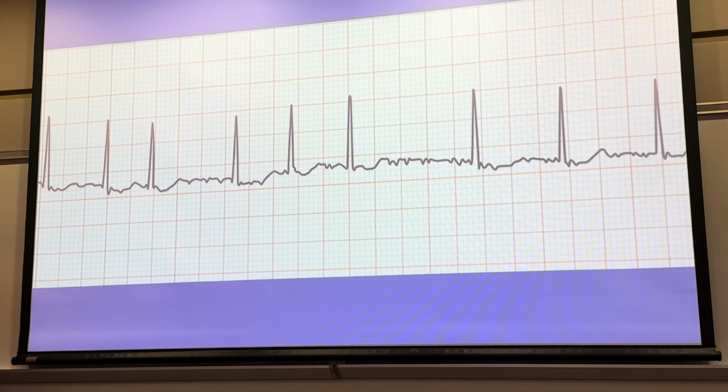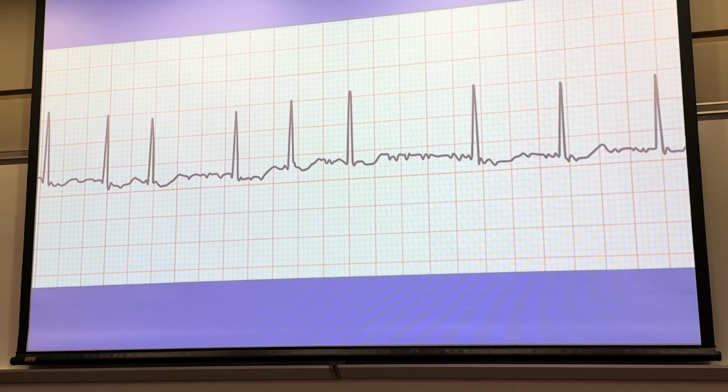All right, Chuck, what do I have? AFib. AFib, you sure? Everybody agree with Chuck? I agree with Chuck. Okay. Anything in particular that I need to worry about with AFib? Clots, okay. Remember, those atriums are quivering, and that blood is not able to further perfuse into the ventricle. So when we have that accumulation of blood that gets stagnant, that can form clots, and then we could push those clots downstream, causing an MI or a stroke, something along those lines.